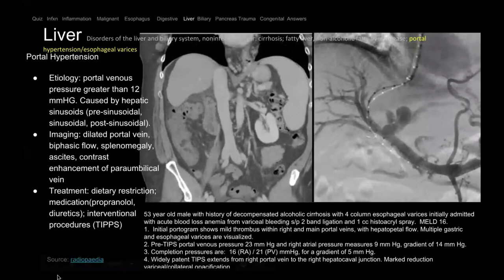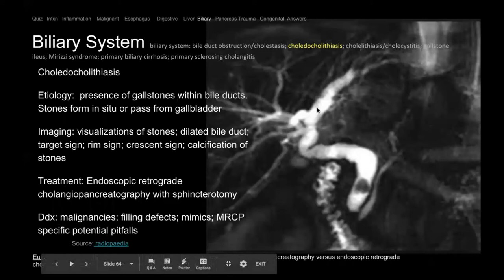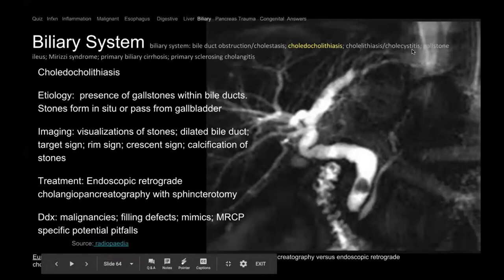CBD stones. Here we have an MRCP — which looks at the biliary system. The CBD, right and left hepatic ducts are severely dilated because of a filling defect — a stone in the CBD. Sometimes it can migrate from the gallbladder. The gastroenterologist can go in with ERCP endoscopically, perform a sphincterotomy to open the ampulla, then do a balloon sweep to remove the CBD stone and relieve the obstruction.